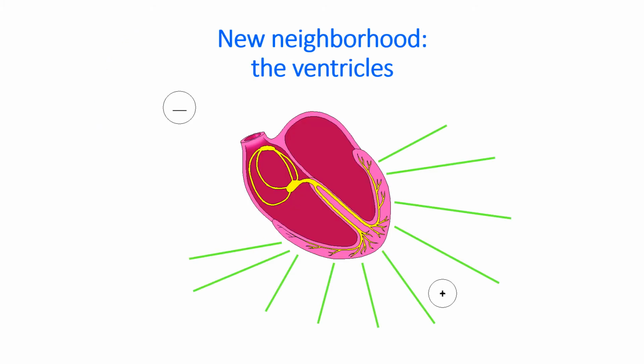So again, we talked about the depolarization. Normally, the flow of electricity will come through the heart from the top and work its way down to the bottom. It will produce a positive deflection because it's coming from a negative and going to a positive. That's the normal conduction. However, this impulse is coming from somewhere in the ventricles. And if it does, what happens is it's going in the opposite direction through the ventricles, but it does not go back up into the atrium.